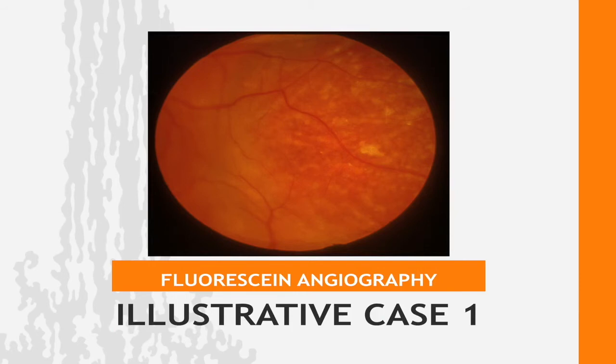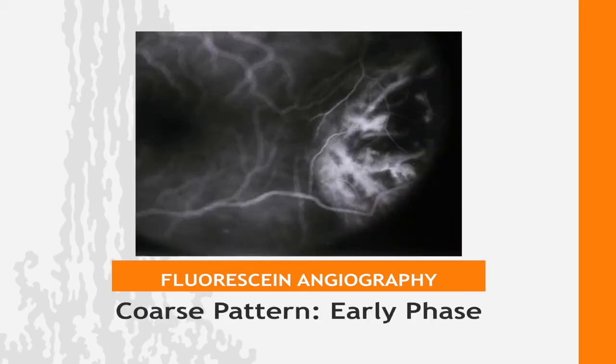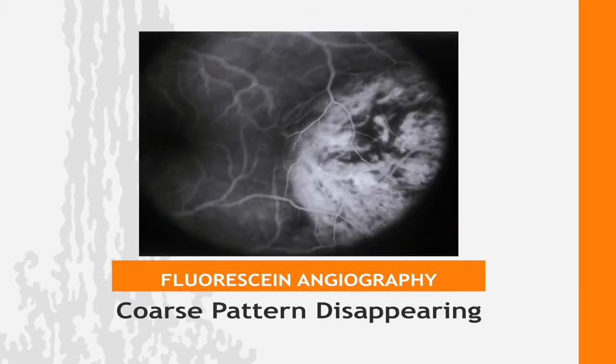So here's a fluorescein. Here we have our hemangioma, the reddish tumor. You can almost see that there are vascular spaces in there, but when you start the angiogram, you can definitely see this coarse vascular pattern. If you remember, the melanoma had almost tube-like blood vessels, and the metastatic lesion just sort of leaked, had very poorly formed vessels. But the hemangioma has jagged and well-formed vessels. You have to catch it early again. If you wait too long in the angiogram, it's just going to fill, and you won't see the jagged edges or the coarse vascular filling associated with hemangioma.